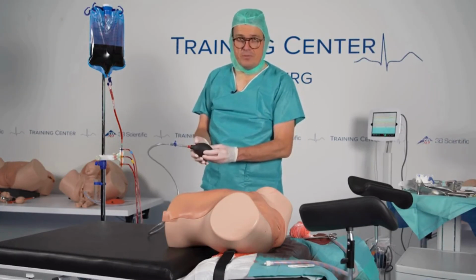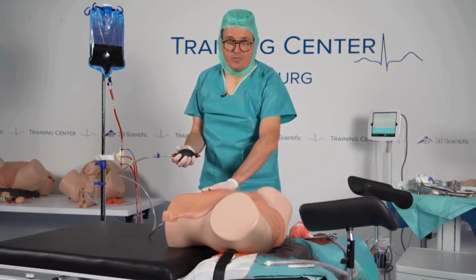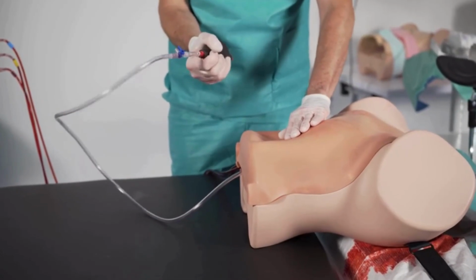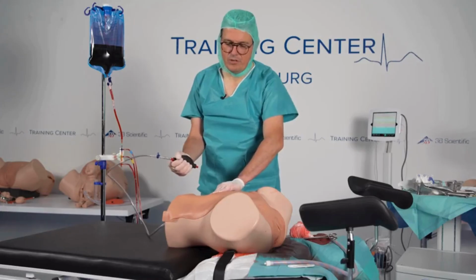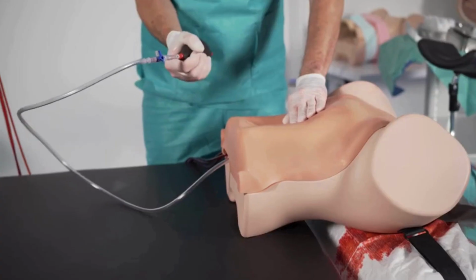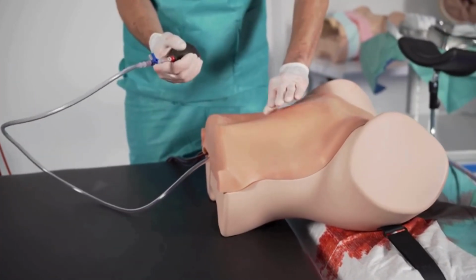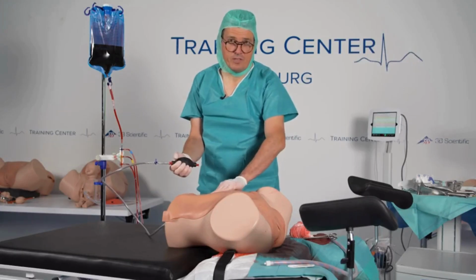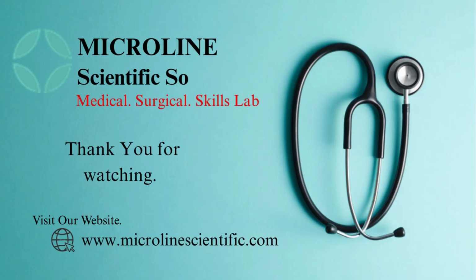You have a little vacuum pump, and with the vacuum pump you can reduce the volume of the uterus very easily and put it on, and you can feel the fundus. And the fundus is going down, and it's going down, and it's going down. And the uterus, the same way, is getting from soft to hard. So it's also a different feeling. Very realistic, like in real obstetrics. And also you can reverse that effect by just letting air come back in.